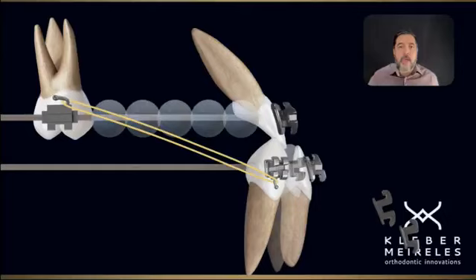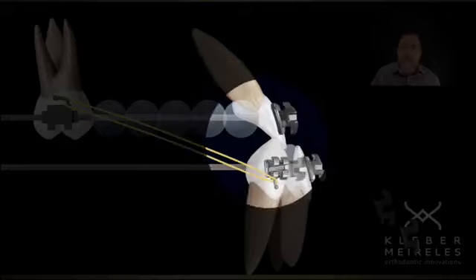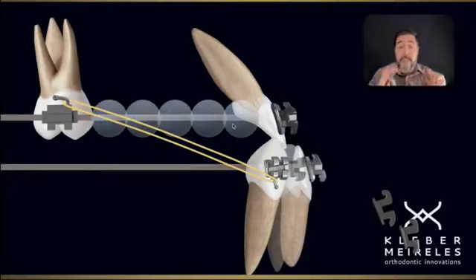And what's going on? Oh, well, we have the contact points here, and we are applying the force in the molar. I'm not thinking about the oblique forces and the vertical forces, just thinking about the inclination of upper teeth, and because of that, I'm just focusing on this condition.